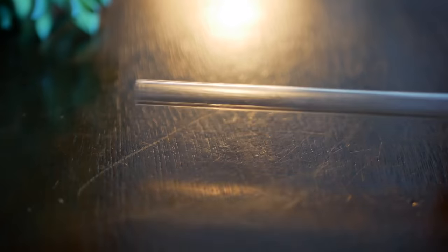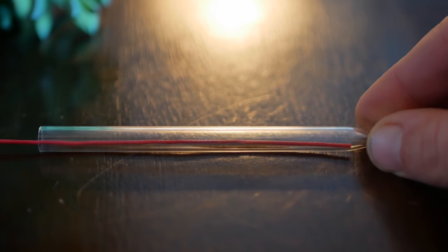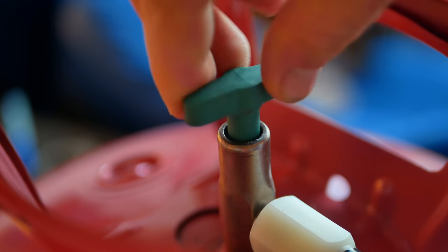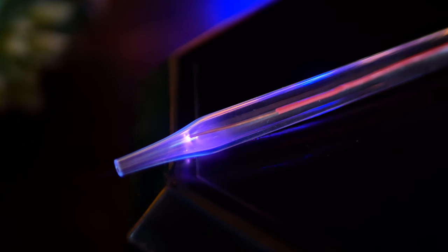The goal is to ionize helium atoms in a way that they don't really have time to heat up, and then go ahead and direct that ionized gas to a specific point. To accomplish this, an electrode is generally placed inside of a tube of some sort, and a gas line attached. When helium flows through it, if that electrode is at high enough voltage and frequency, it'll ionize the helium inside the tube, and if the helium flows at just the right rate, the ionized gas can exit the tube before it warms up, while maintaining an ionized state.